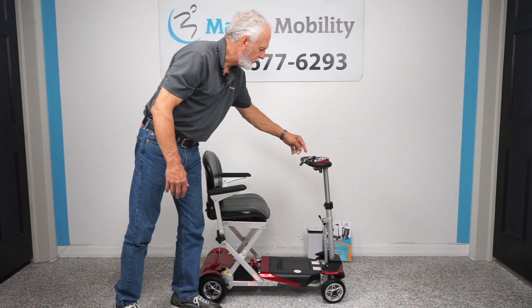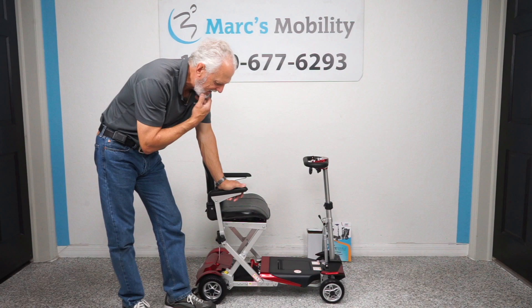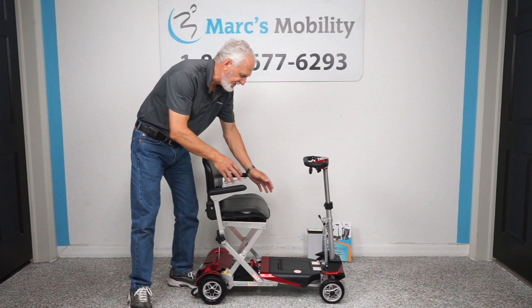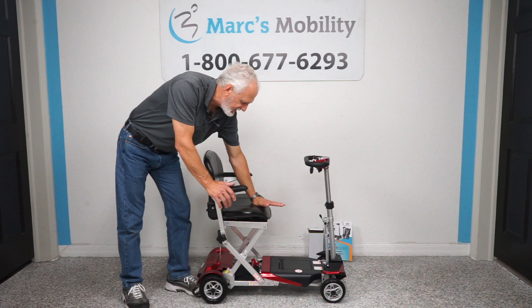This is the new Enhanced Mobility Transformer redesign for 2023. This scooter has a 300 pound weight capability. The seat on it is 17 inches wide by 14 inches deep — remember that, 17 wide by 14 deep. The seat sits at about 22 inches from the ground to the top of the seat.